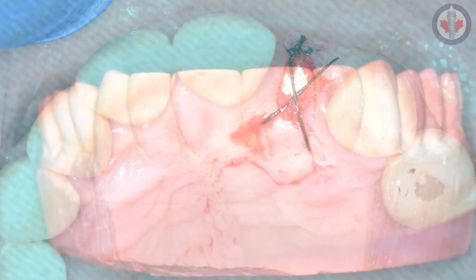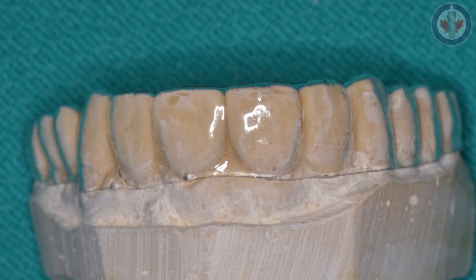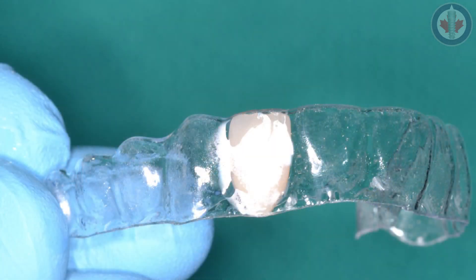We send the patient off for a week and take the suture out at that point. For temporization in this particular case, we had made an impression of the patient in advance and made a little SX retainer with some composite added to it, so the patient can wear it as a temporary.